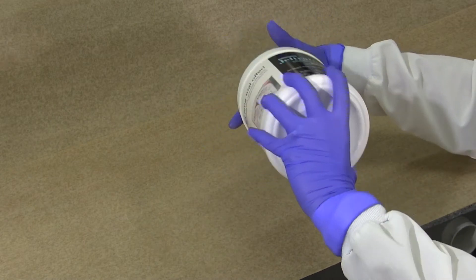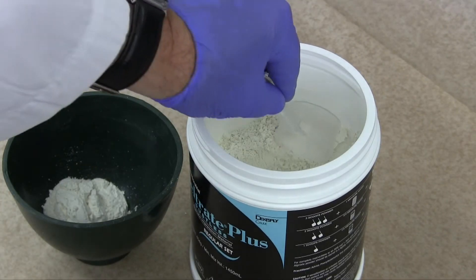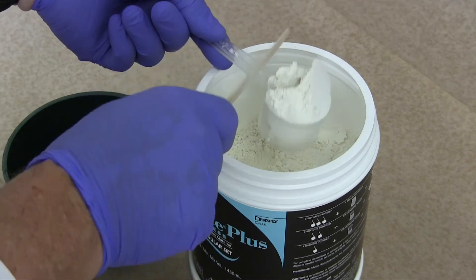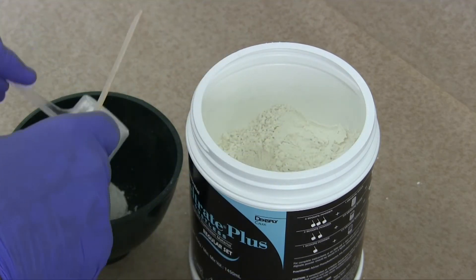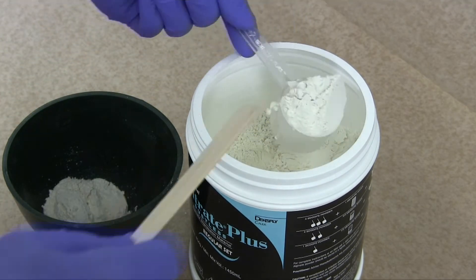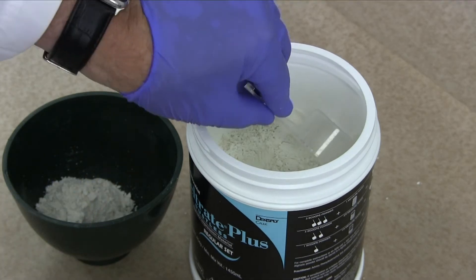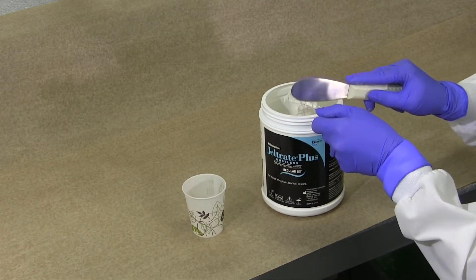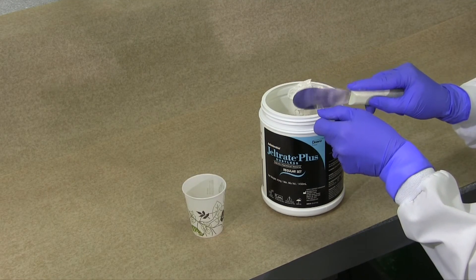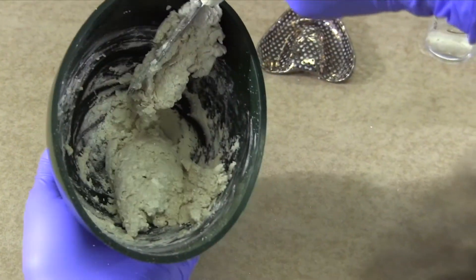Prior to measuring the alginate powder by volume, rotate the sealed container a couple of times if you believe the material has settled. For most impressions, three scoops will be sufficient when using the syringe technique. When measuring alginate, scoop, tap several times, level the scoop, then empty it into your bowl. If you tap excessively before leveling your scoop, you will change the density and hence the mix of your material. This is normally undesirable.